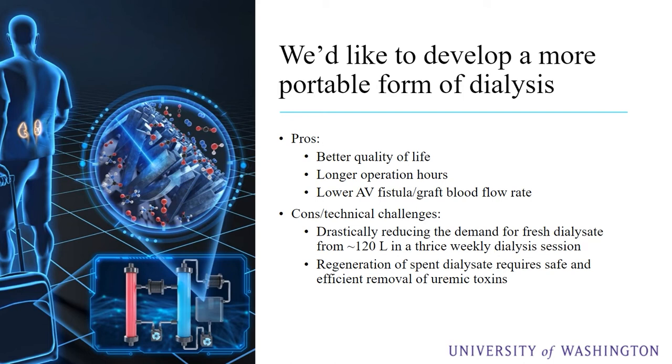However, it's technically challenging because we then have to reduce the demanded fresh dialysate from 120 liters in a dialysis session to maybe a few liters. That will make it portable. By doing that, we have to regenerate the spent dialysate and remove the uremic toxins safely and efficiently.